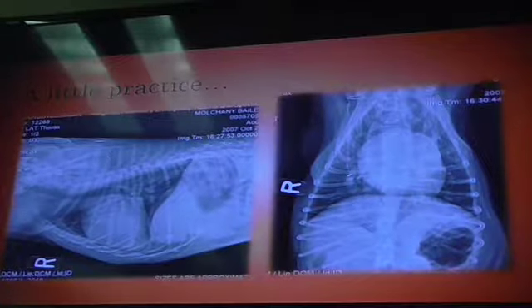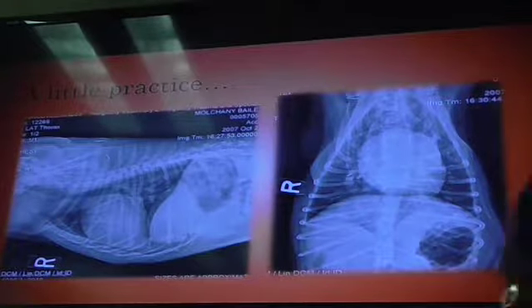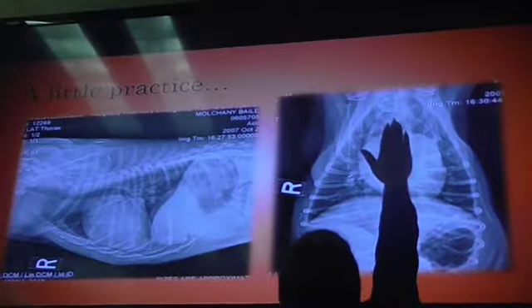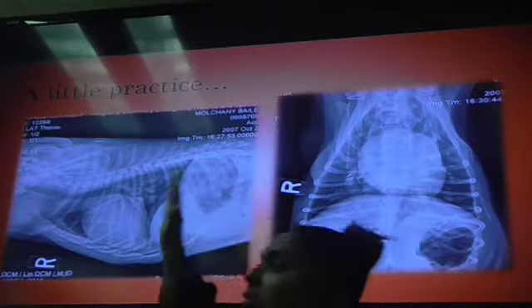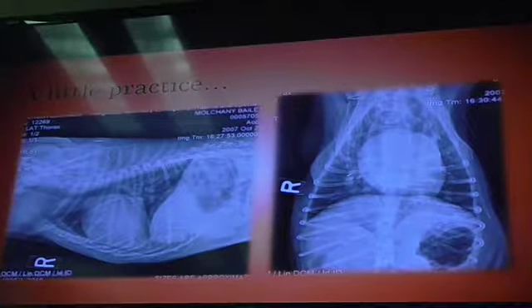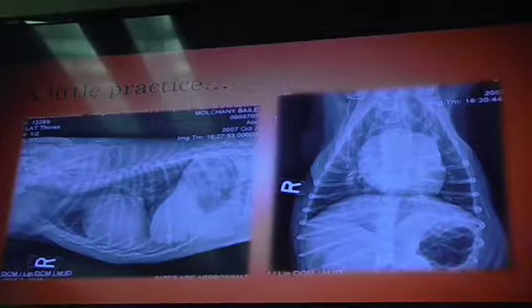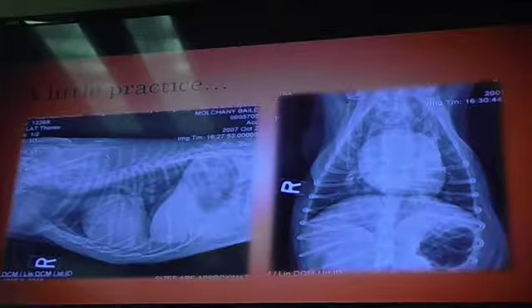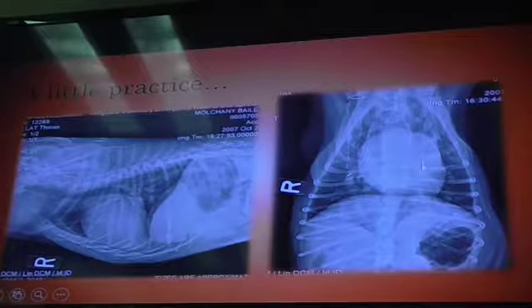So what you're going to do, and this is a trick that Dr. Perry taught me, is you sometimes just put your hand over that area and see does it make sense. All right? So sometimes you have to block what you think is helping you kind of circumscribe that area. Block that and see how it continues on. Okay, so if that spine of that scapula wasn't there, this would just look like one lung lobe just coming down.